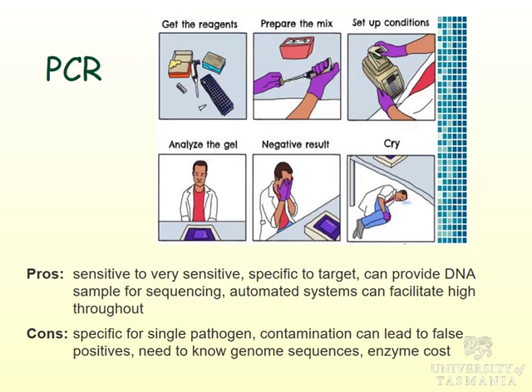You can automate it. They've got robot systems now where you get your samples, you pop them into bags and you press a button and it kind of squishes them all and extracts it all and runs the whole assay and gives you results at the end. So again, high throughput, works really, really well.